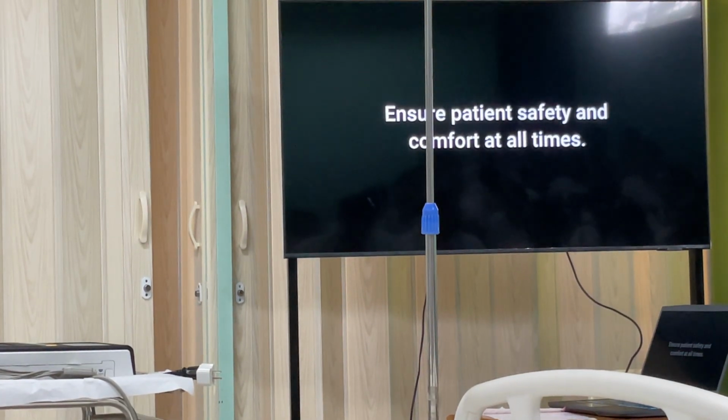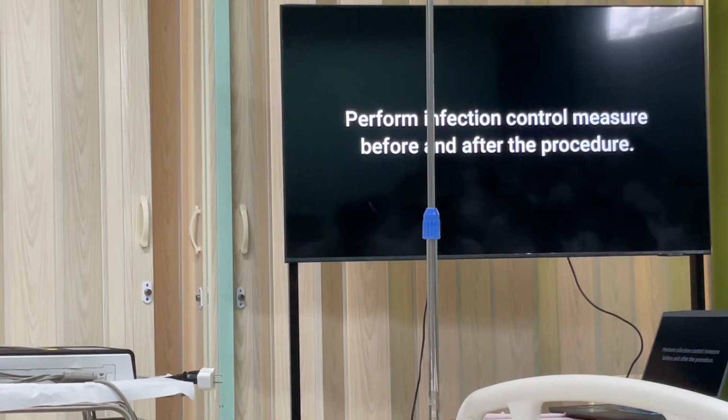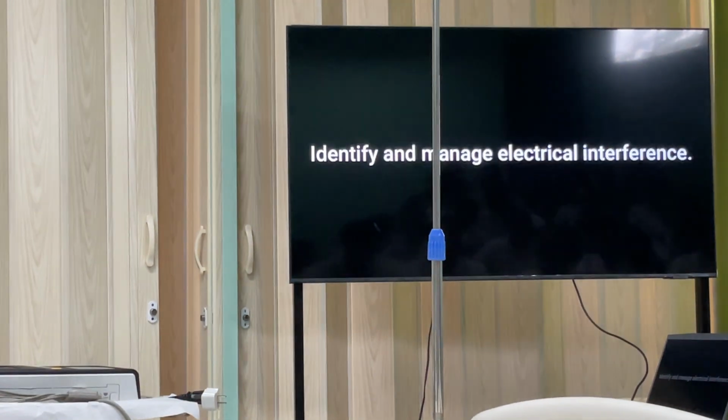Ensure patient safety and comfort at all times. Perform infection control measures before and after the procedure. Identify and manage electrical interference.